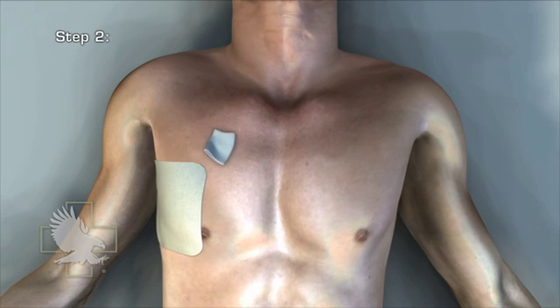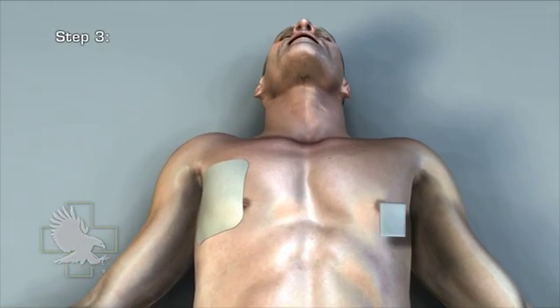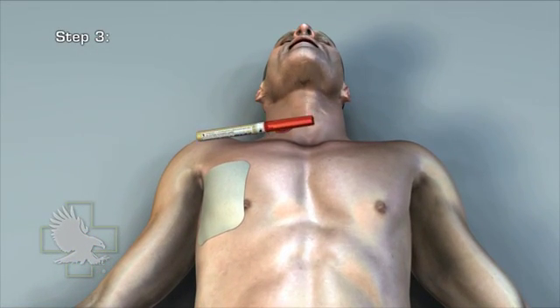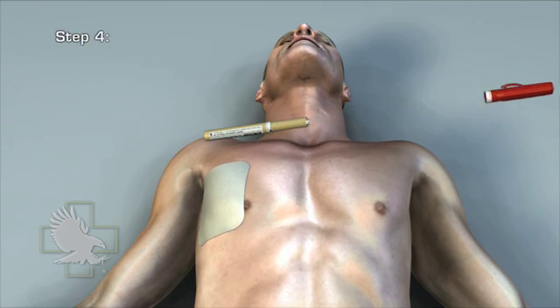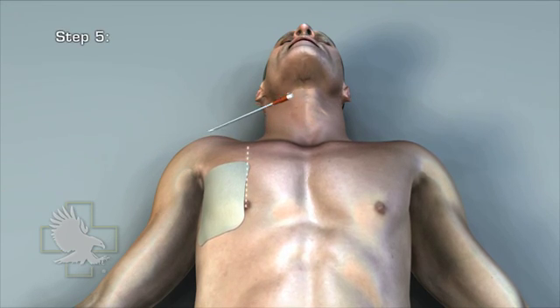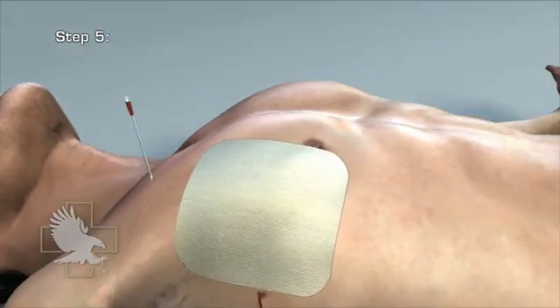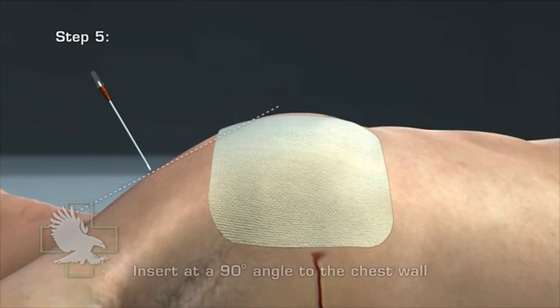Step 2: Cleanse the site with antimicrobial solution. Step 3: Remove the red cap with a twisting motion. Step 4: Remove the ARS from the case. Step 5: Insert the needle into the skin over the superior border of the third rib, mid-clavicular line, and direct it into the intercostal space at a 90-degree angle to the chest wall.